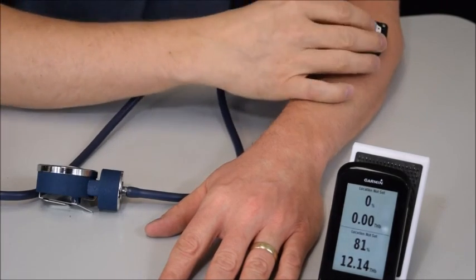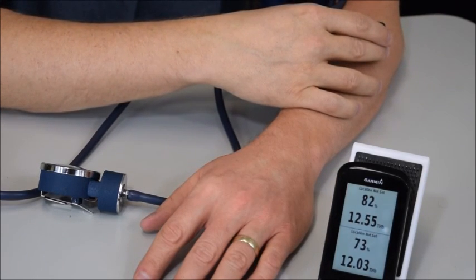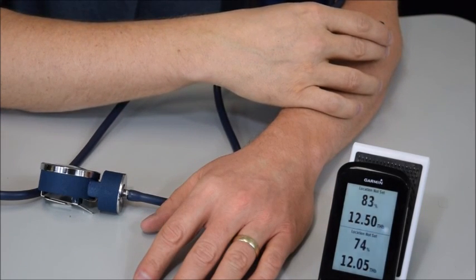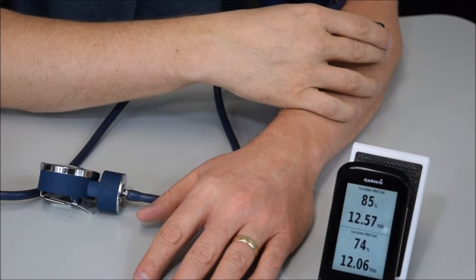And then if we look at the Moxie reading in this case, give that a second to update. So now the Moxie is reading in the 85, 83 kind of range. So the Moxie just has a much bigger dynamic range because it's able to sense what's going on on that 0 to 100 scale much more appropriately.